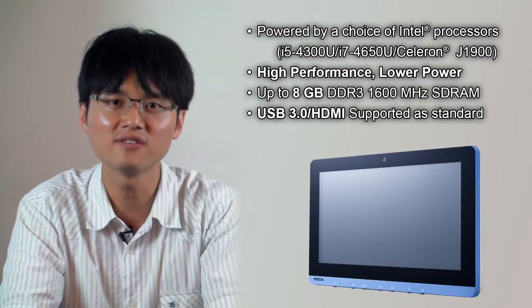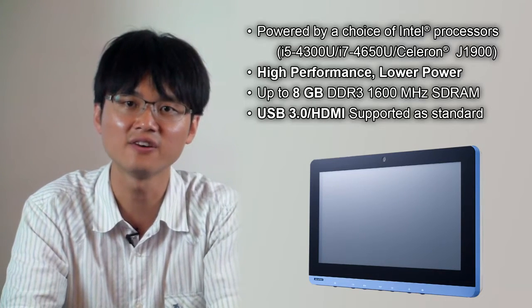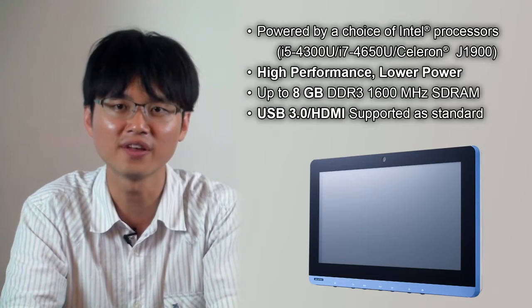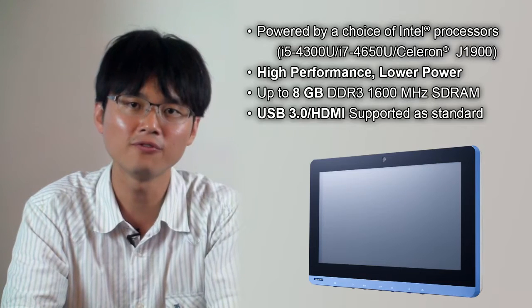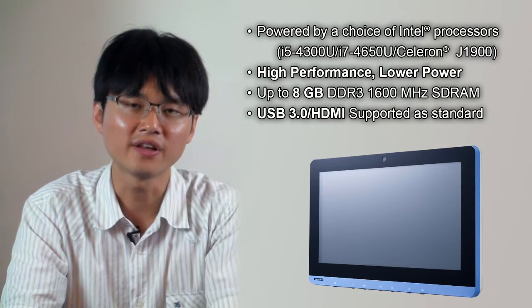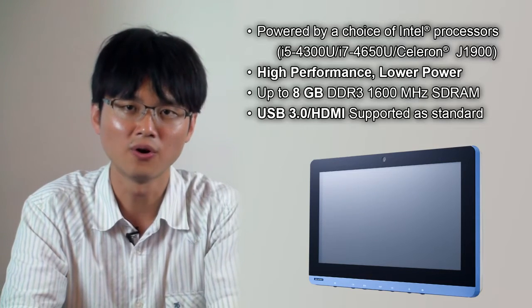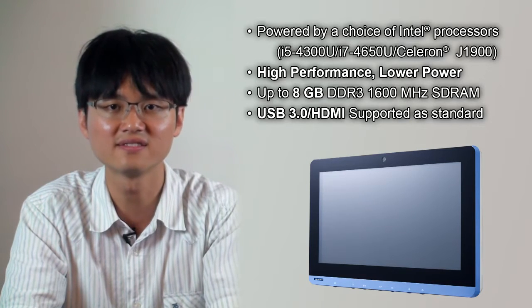Powered by the Intel Bay Trail or Haswell platform, you can select an Intel Core i5, i7, or even Bay Trail J1900 processor. It's higher performance than before, but under low power. It can use up to 8GB SDRAM, with USB 3.0 and HDMI-supported standouts.